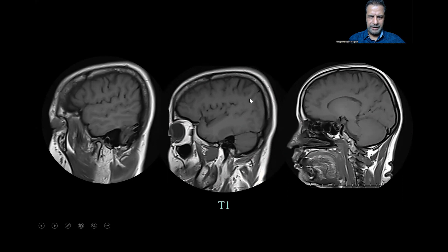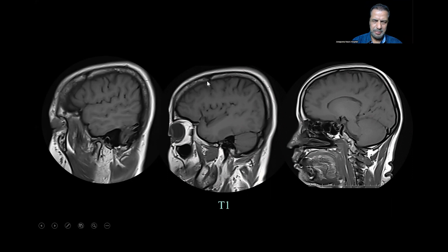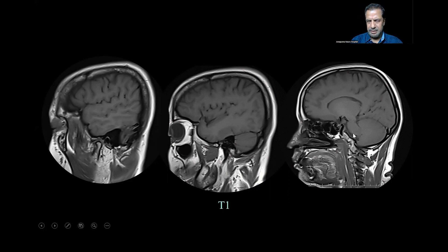The coronal suture is seen again — that's also a very important landmark when operating. If you are confused about the central sulcus in the center, you can go a little bit lateral and then determine where it is. As you go a little bit further medially, you can see the cerebral peduncle and a little bit of the pons. The cerebellum is being seen there, and that's the occipital lobe.